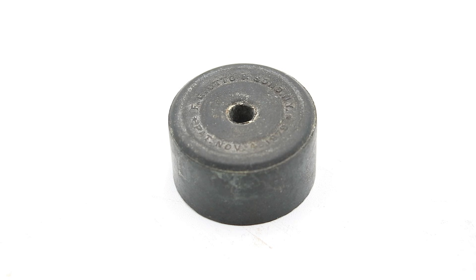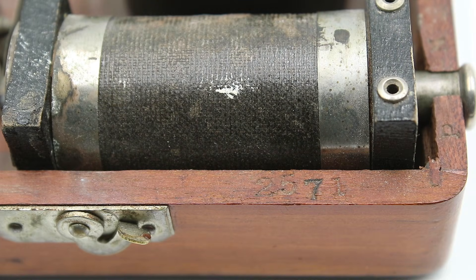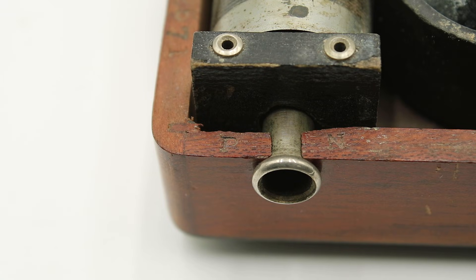An interesting detail: if we flip over the anode cup, we'll see that it is stamped F.G. Otto and Sons of New York — this is the same F.G. Otto that submitted the patent for those little electrical connectors. Other markings include the patent date November 4th, 1879, as well as the serial number 2571. This doesn't necessarily mean that many units were produced, because a lot of companies at this time tended to start their serial numbers at 1000 or even higher to give the impression that more units had been sold than actually were. And we have P and N indicating the positive and negative terminals of the coil.